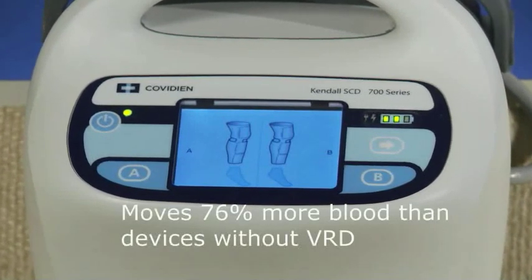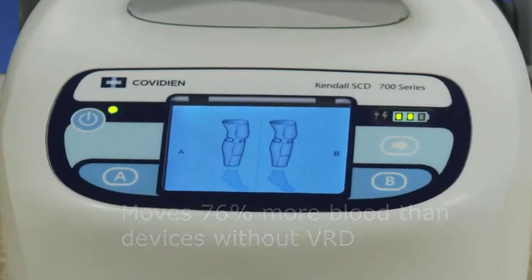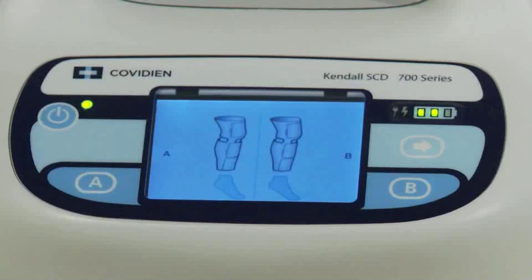VRD has been clinically documented to move seventy-six percent more blood versus a device without VRD. Vascular refill detection is yet another way that the Kendall SCD 700 series clinically differentiates itself from other devices in the marketplace.